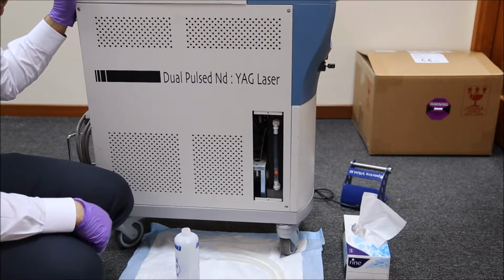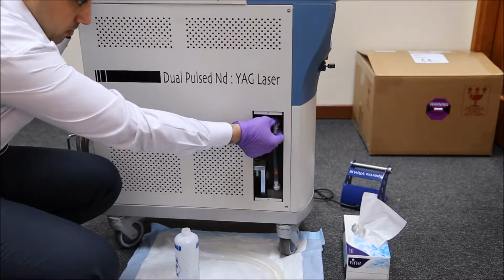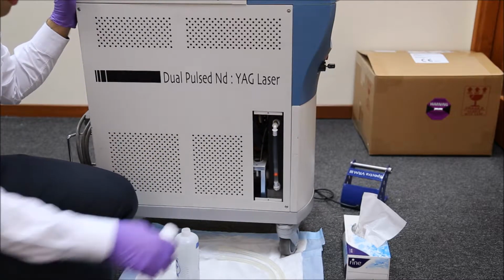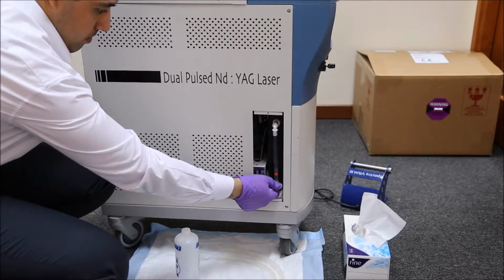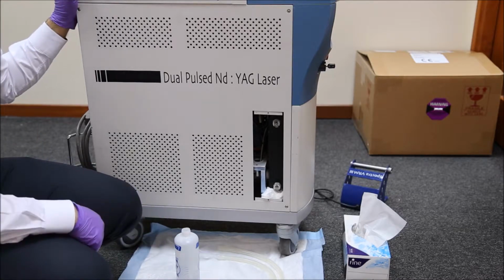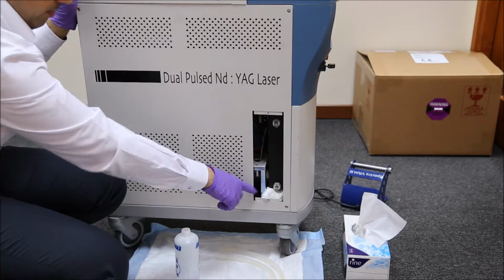3. Pull out the upper connector of the indicator tube by pushing the valve of the upper inlet. 4. Pull out the lower connector of the indicator tube by pushing the valve of the lower inlet. At this time, because the distilled water inside the indicator tube flows out, put a piece of cloth or tissue under the lower connector.